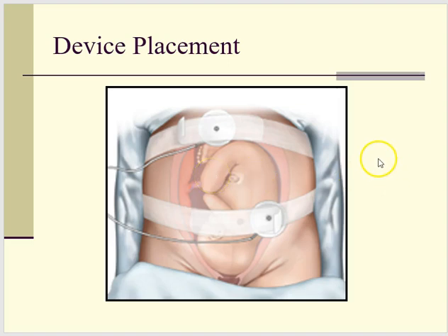This means you have to palpate the uterus to find the best spot to pick up those contractions. The ultrasound device, in order to pick up the fetal heart rate, in a perfect world, will be in about the lower left or right quadrant. You can see how here we're aiming to go basically through the baby's shoulder so that that device can pick up those Doppler ultrasound waves fairly easily. Babies move, they wiggle. If you have a breech baby that's the other direction, you may be searching for that fetal heart rate for a little while.